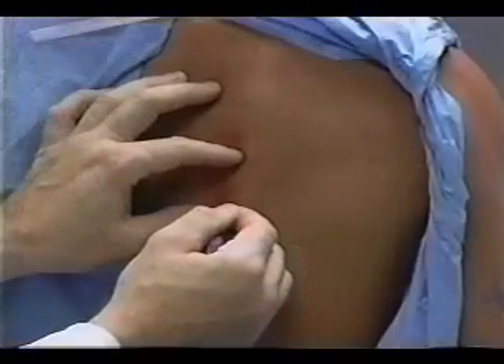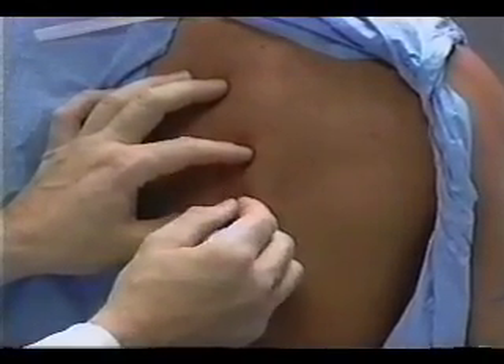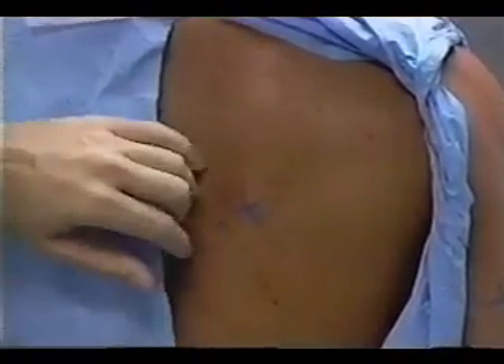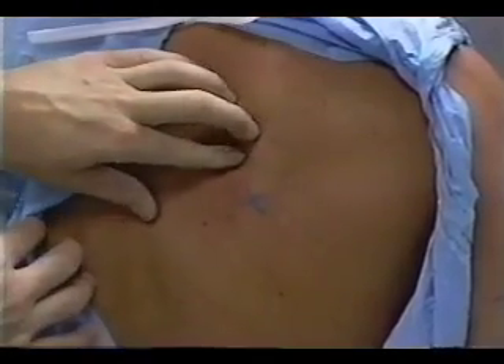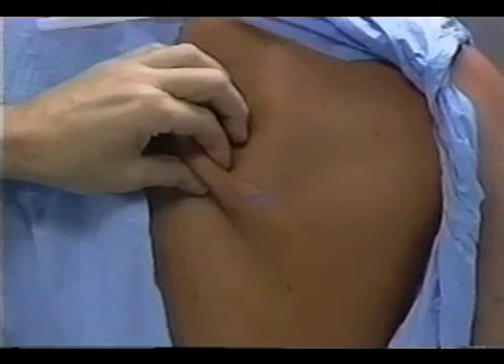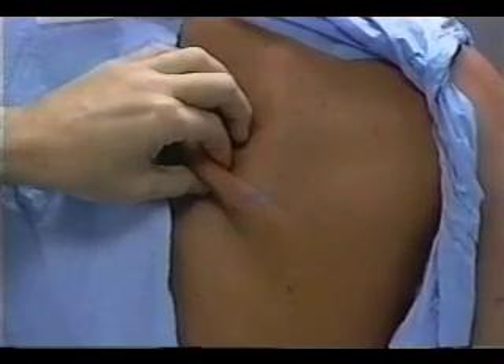A mark is made on the inferior angle of the scapula. The technician gently lifts a fold of skin and subcutaneous adipose tissue with the index finger directly above and medial to the mark at the inferior angle of the scapula, and with the thumb reaching toward the spine.